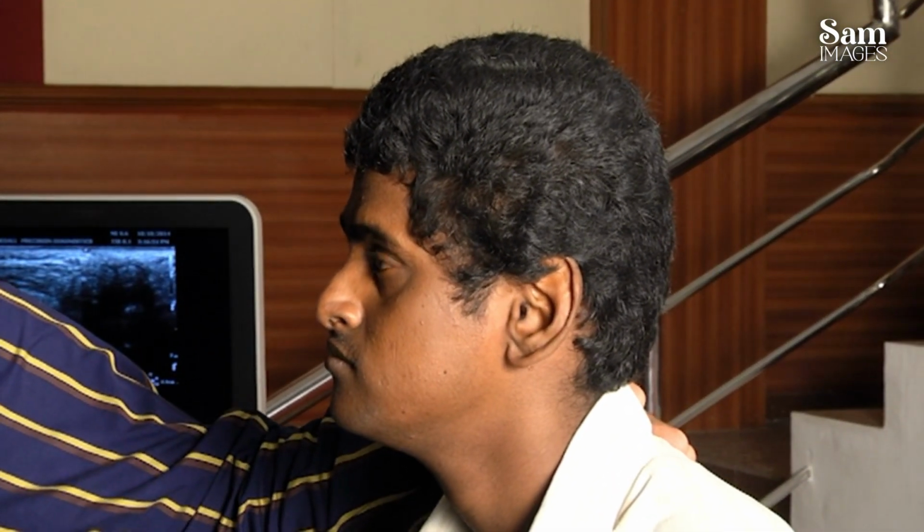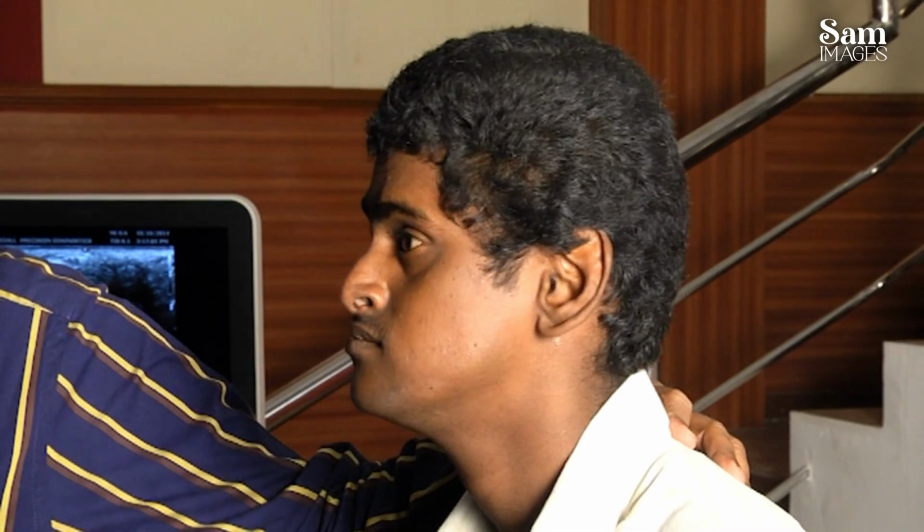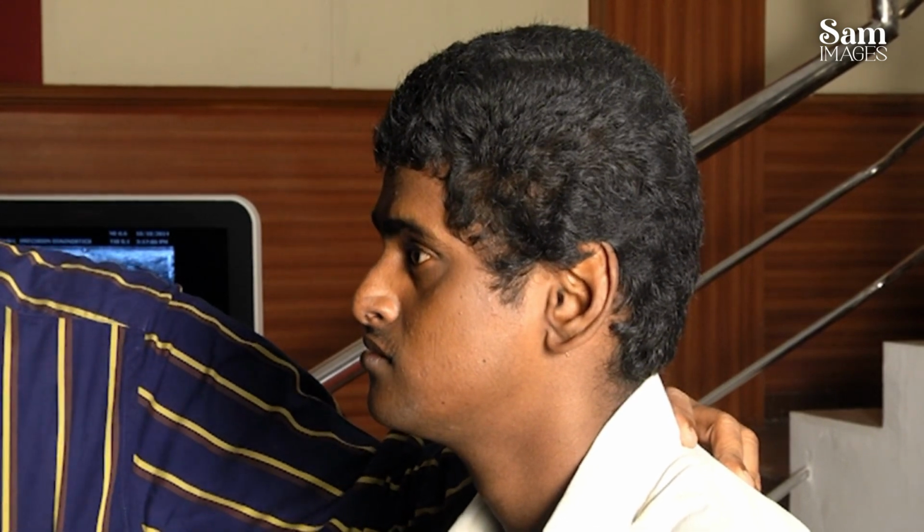You see, the patient has got earache. Earache, and the previous patient I have shown, he is not able to open the mouth completely. Only 50% he is able to open. But here you see this. See, he is able to open that mouth, right? Almost 80-90% he is able to open that mouth.